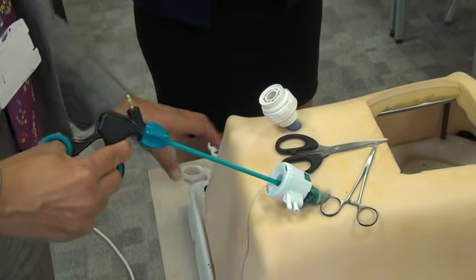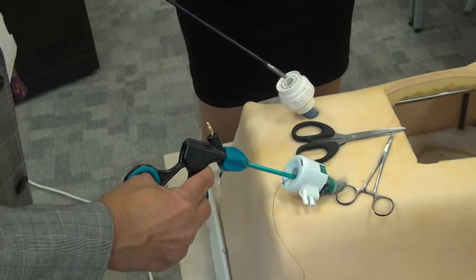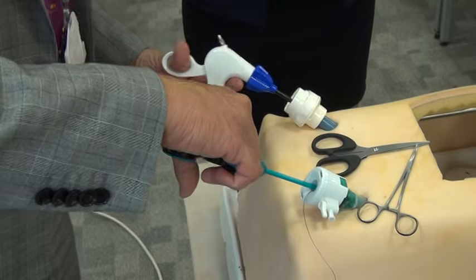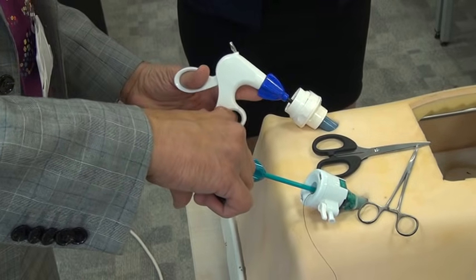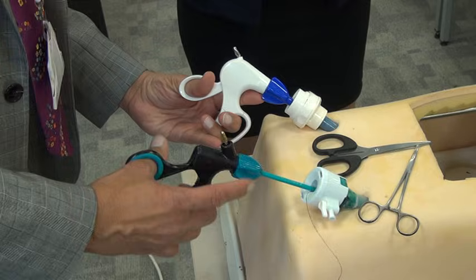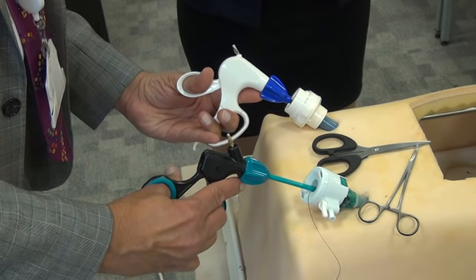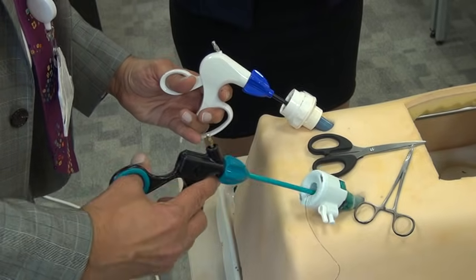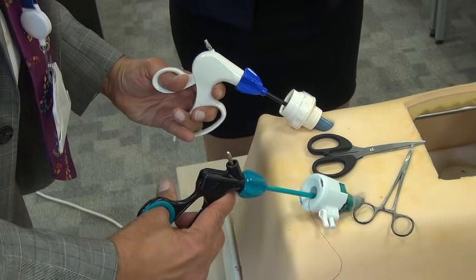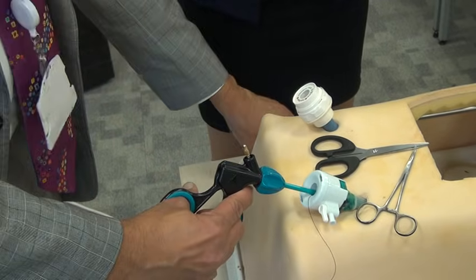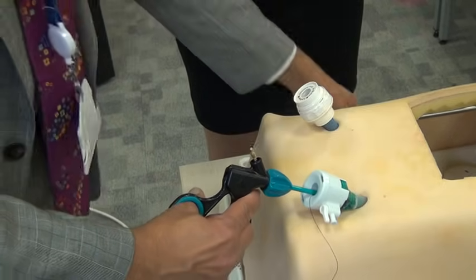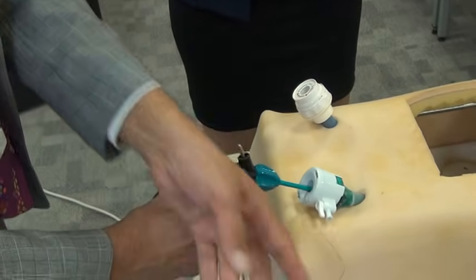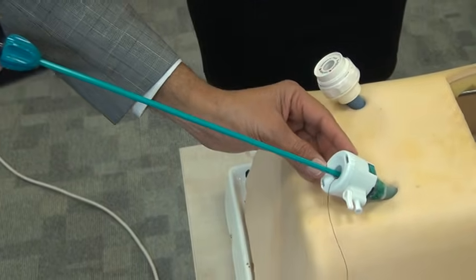You pass it in, pass it around the tubular structure you want to tie. And it will come out through the same port. We've already left this on the right. And now as it comes out, keep it in the neutral position.